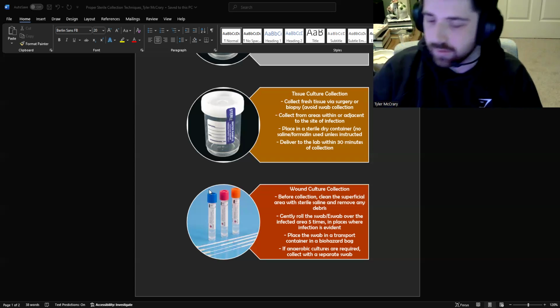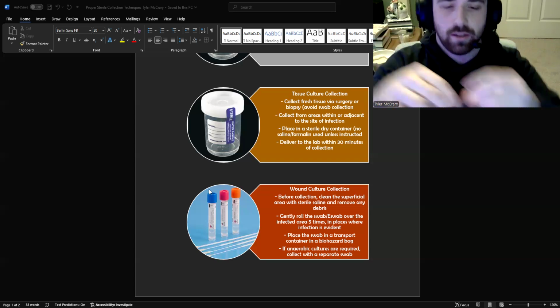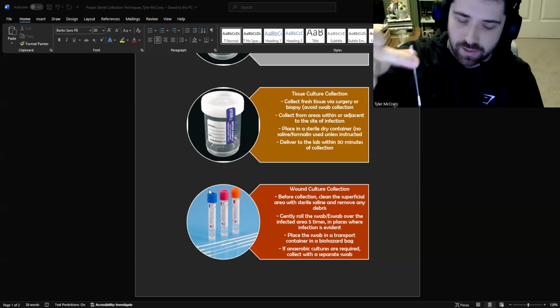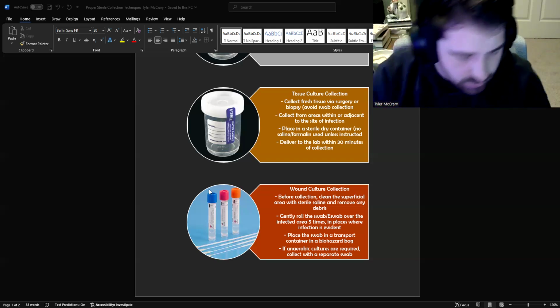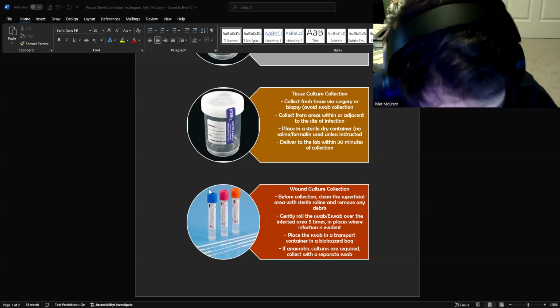stick it in another sterile container like this or something more designed to fit the swab. You can just stick it in there, break it off. So I broke it in two pieces so it can actually fit in the container. So that's one way of doing it. A lot of times, mainly e-swabs are used the most now for wound cultures.